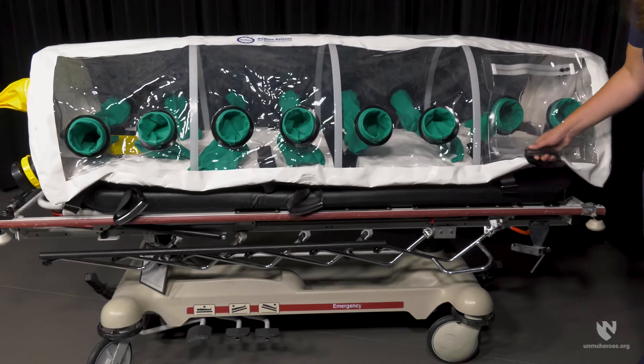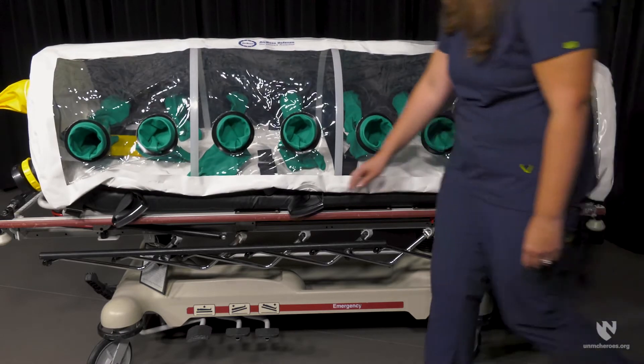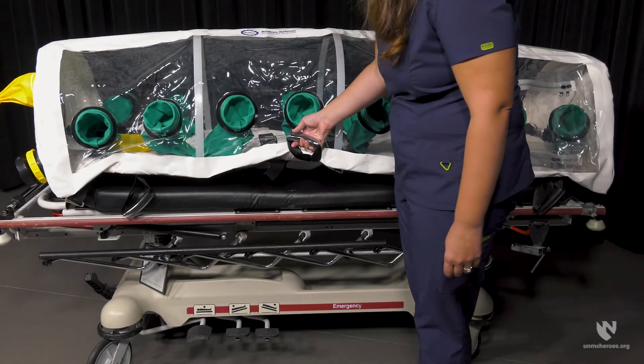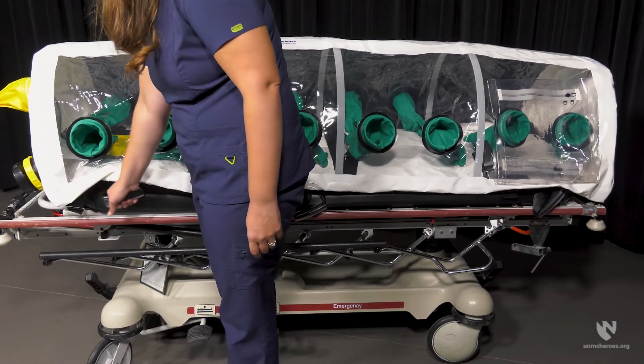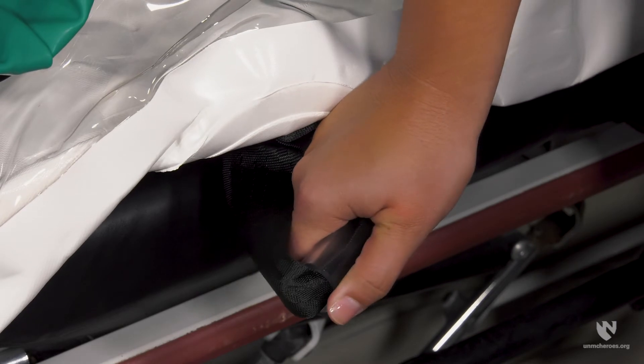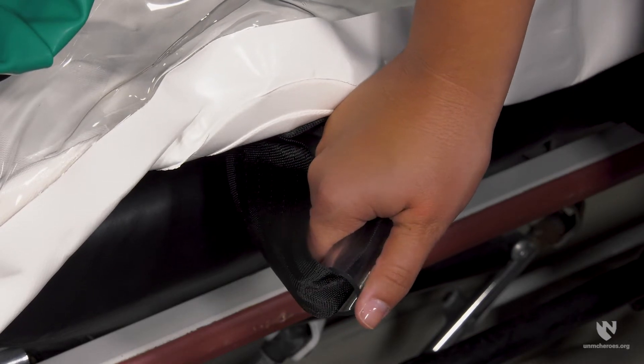The use of the spine board allows for better control during patient transfers. The other update to the isopod is the addition of handles along the sides of the device. Three handles have been added on each side to allow for better control during patient transfers. Each handle is made from the same material as motor vehicle seat belts and is wrapped in a plastic tube to provide additional comfort while being held.